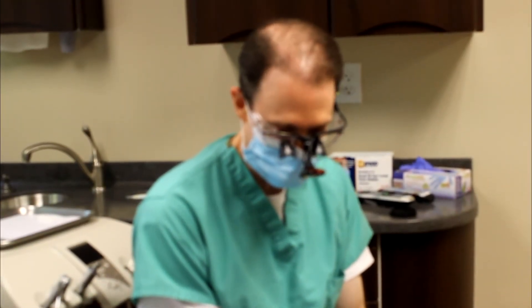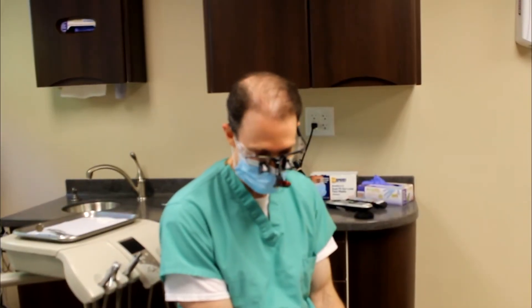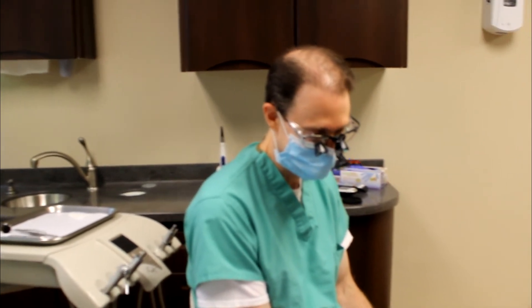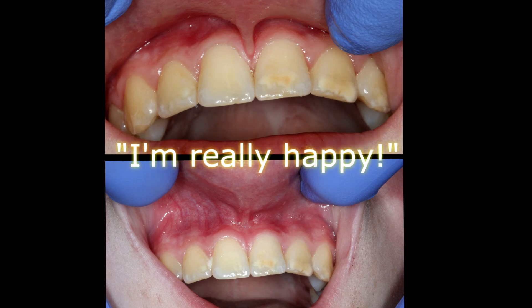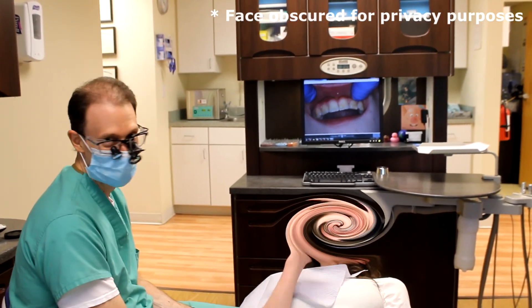What was the worst part of the procedure? Probably just like the smell or something. I thought you were going to say that. Most patients say that the occasional odor is the worst part. I didn't really feel it after. Are you glad you did it? Yes, I'm actually really glad. At first I was really scared but now I'm glad I did it. It turned out really well. I was very pleased overall with the frenectomy and I would recommend Dr. Calcutta and his staff.